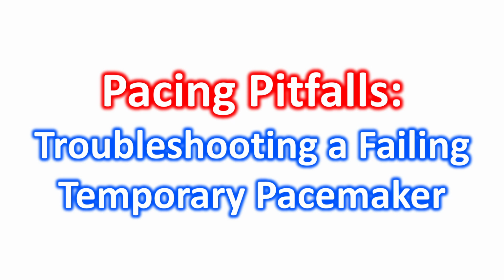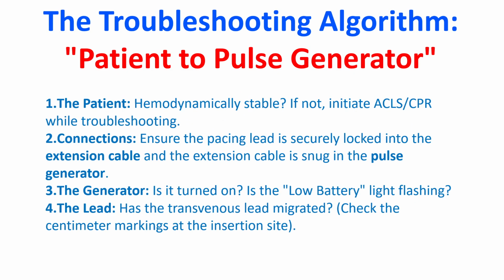A malfunctioning temporary pacemaker is a true code blue waiting to happen. Troubleshooting requires a systematic approach, moving from the patient back to the generator. Here is a guide to identifying and fixing the most common pacing pitfalls. When the monitor shows a problem, check these components in order.